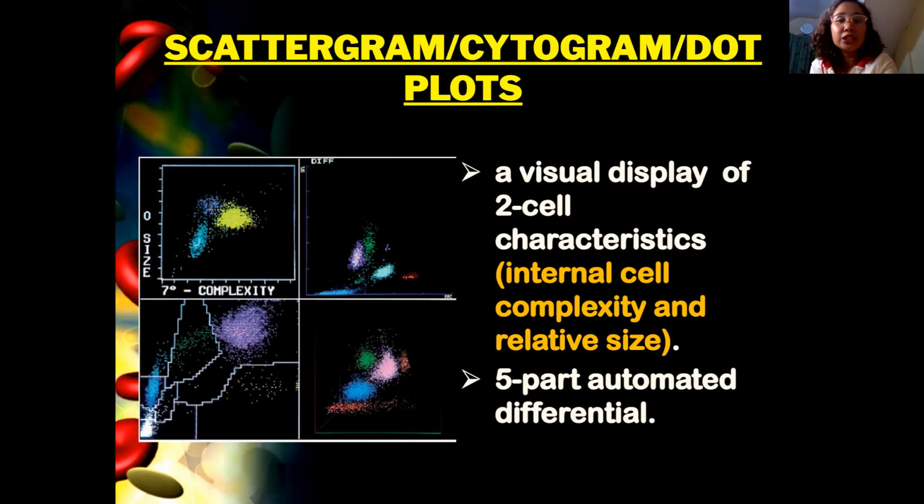We also have scattergrams. This is good. I think this is more accurate in showing where your cells lie. This is also good. It's like a histogram too.